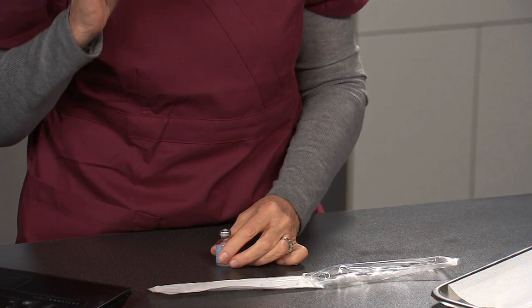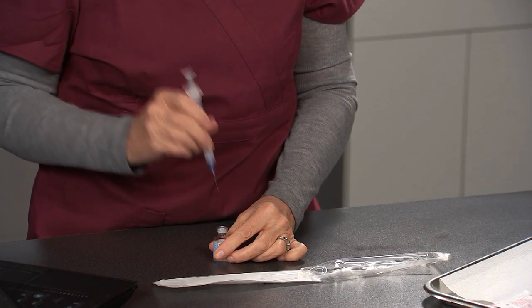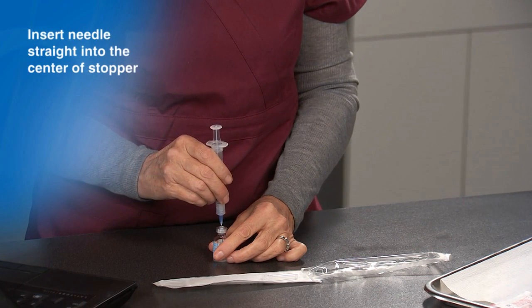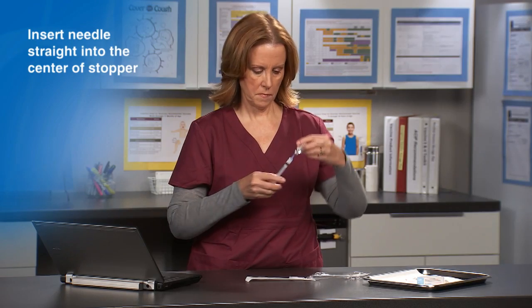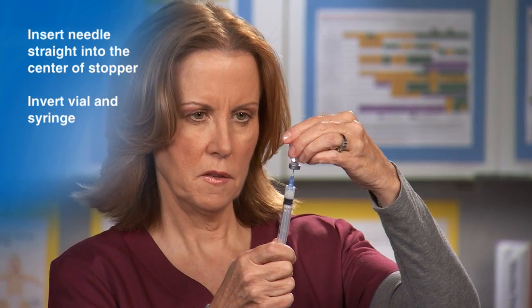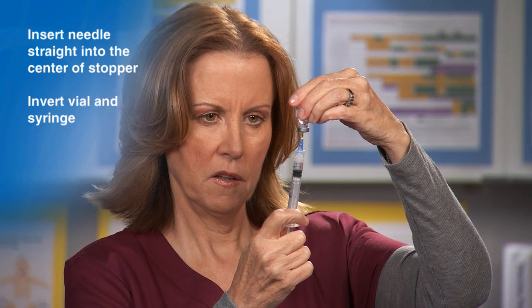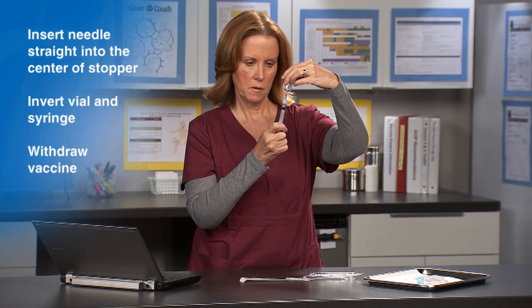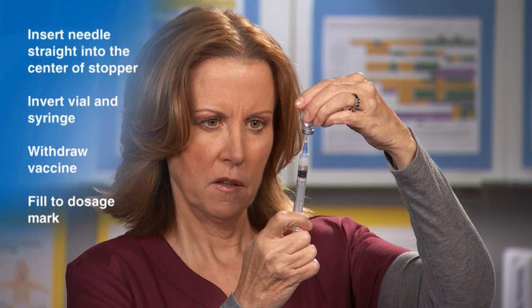Hold the vaccine vial on the counter with your non-dominant hand. Holding the syringe with your dominant hand, insert the needle straight into the center of the stopper. Pick up the vial and syringe together, then invert them. Hold the vial and syringe at eye level and carefully pull the needle back so the tip is in the liquid. Withdraw the vaccine by pulling on the plunger of the syringe, and fill to the dosage mark on the barrel of the syringe.